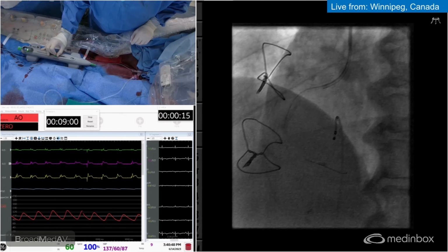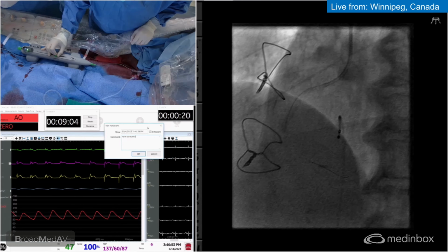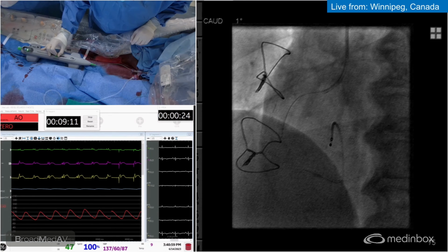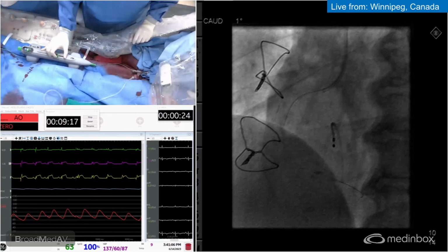There is where I got the first run in. So I'll sit there a bit, then gently advance. Get the 30-second mark there. Yep. I got more room with my advancer here. Should we try the 3.0 again? I think so. I think we just take an NC balloon, try again.